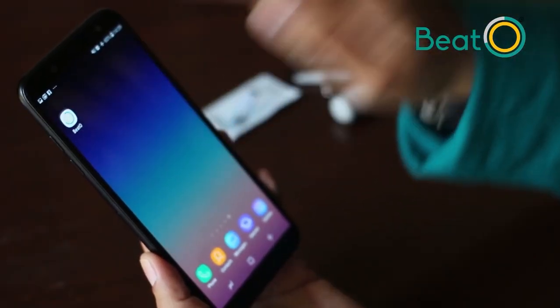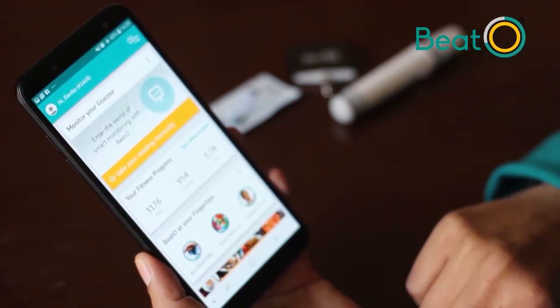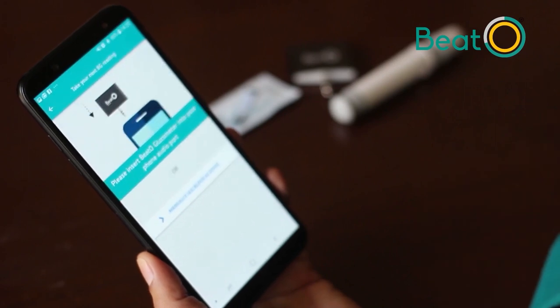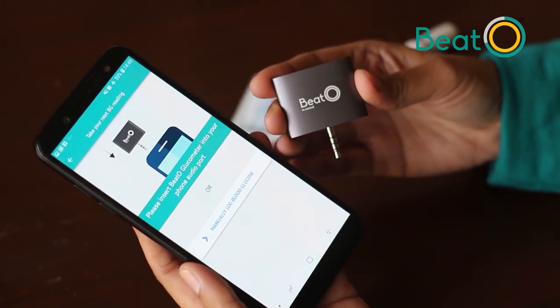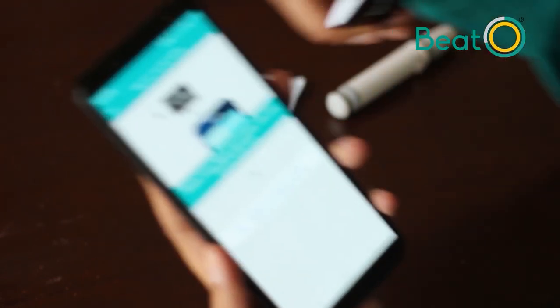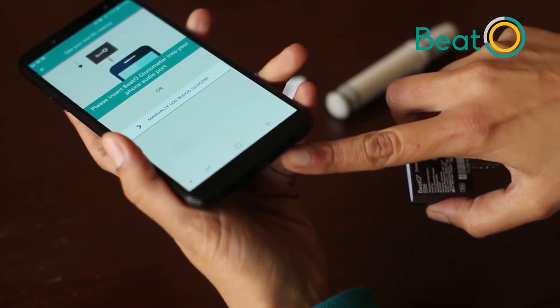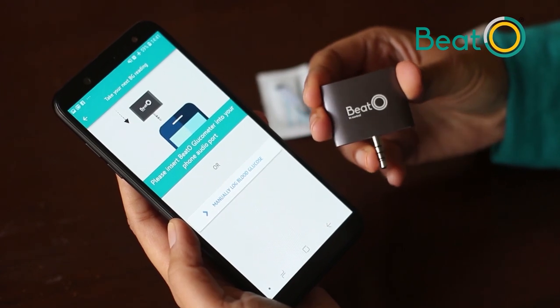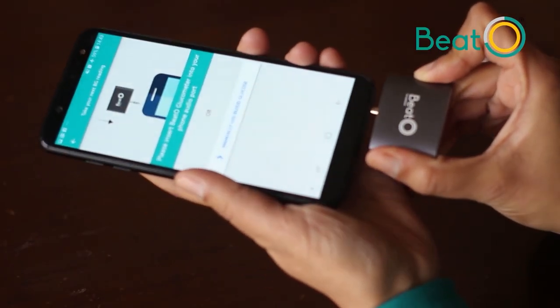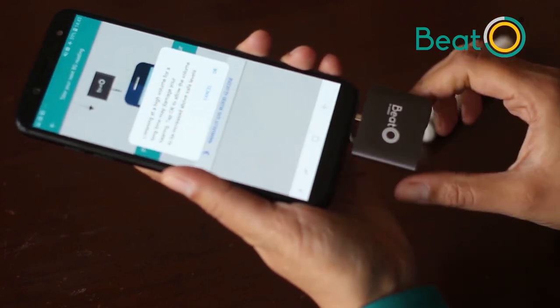To take your reading, simply open the Beto app. Click on 'Monitor Your Glucose.' Take your glucometer and insert it into your phone's audio jack — the audio jack may be at the bottom or top of your phone; it's where you put in your headphones. Make sure you hold it from the sides. Insert the glucometer and wait to hear a click sound.